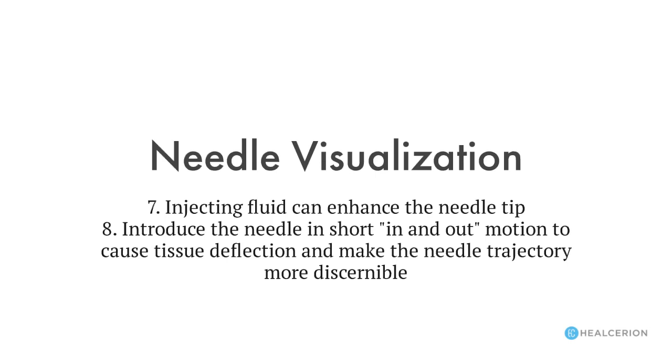And introduce the needle in short in and out motions to cause tissue deflection and make the needle trajectory more discernible.